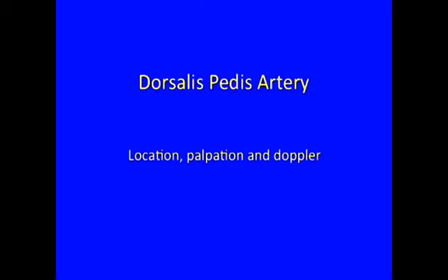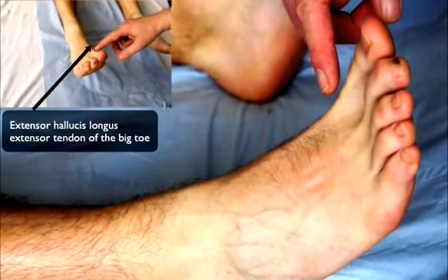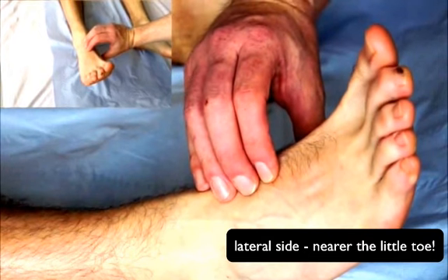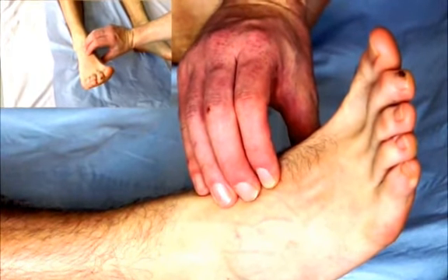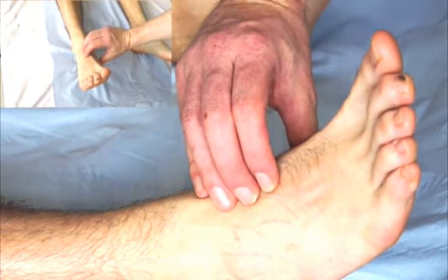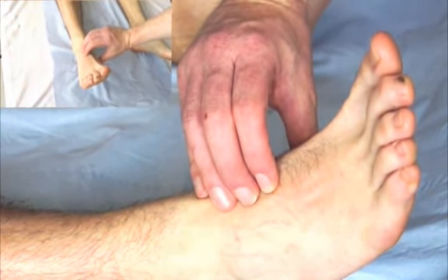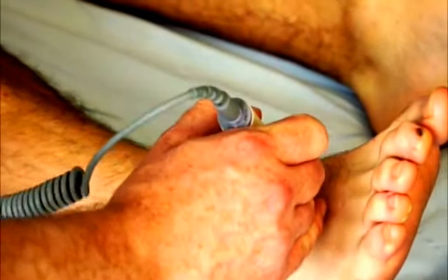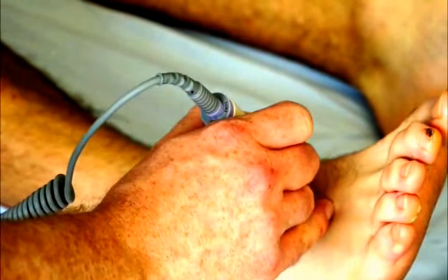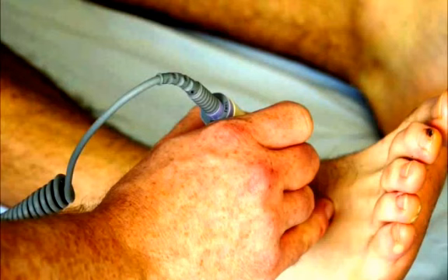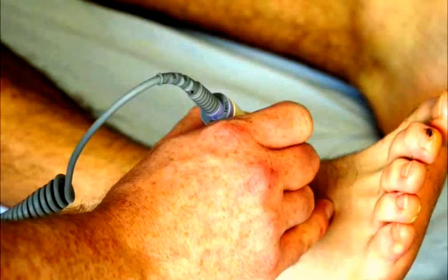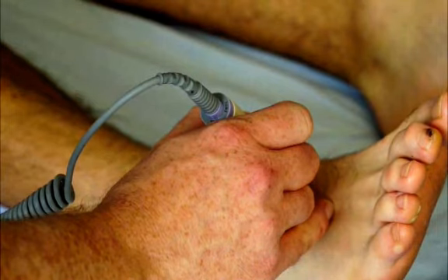Now we'll move on to the foot pulses — dorsalis pedis first of all. The dorsalis pedis is usually found just lateral to the extensor hallucis longus tendon. And there it is, using three fingers to maximise my chance of palpating the artery. Once you've found the pulse, you can then use the Doppler probe to interrogate the pulse. I notice there when you're Dopplering the pulse you've got your little finger just adding some stability. Yeah, so I hold the probe like I'd hold a pencil, and that gives me fine adjustability to move the probe over the surface of the skin, with the little finger to stabilise it.